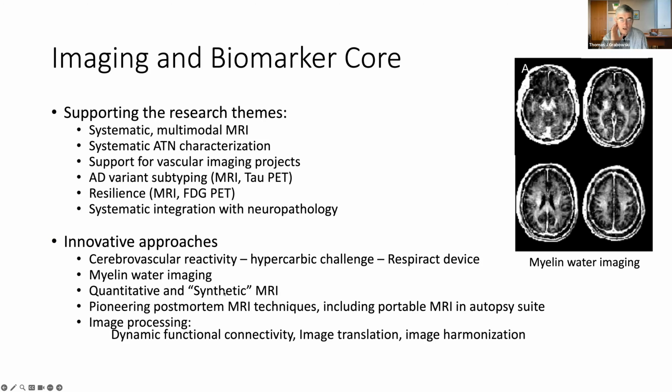We can now efficiently generate co-registered images of the underlying physical parameters of MRI, T1, T2, and PD in an absolute sense, and synthesize any MRI contrast you might want for your study. That has interesting applications and I'll mention it in a little more detail. And a lot of expertise in image processing that I may not have time to get to.